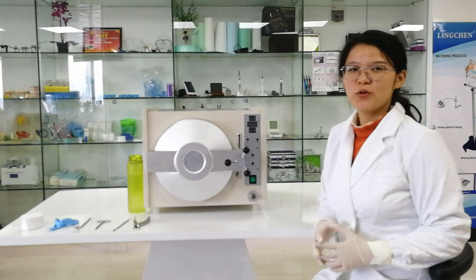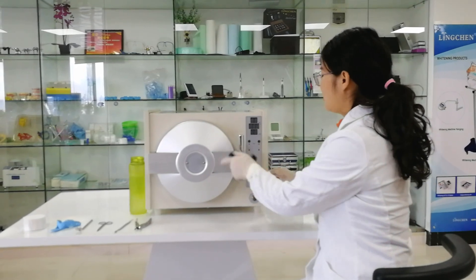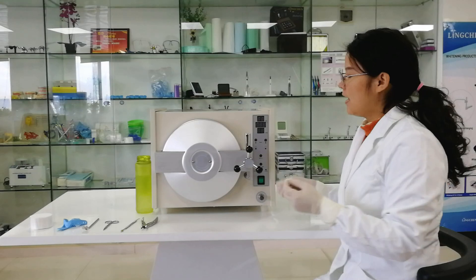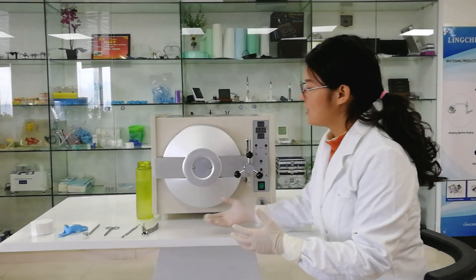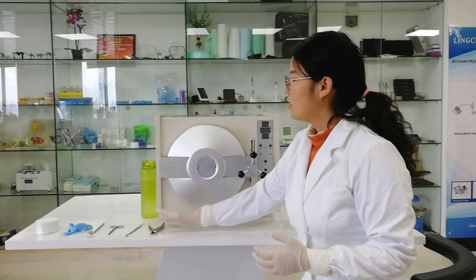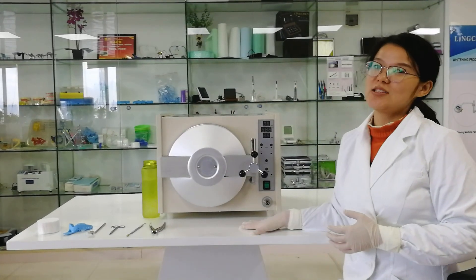Hello, welcome to Linchin Dental autoclave class B, 18 liter. It takes 20 minutes to finish the whole process of sterilization. Today we are going to sterilize materials like the mantle, plastic, and fabric. This is a real class B system.